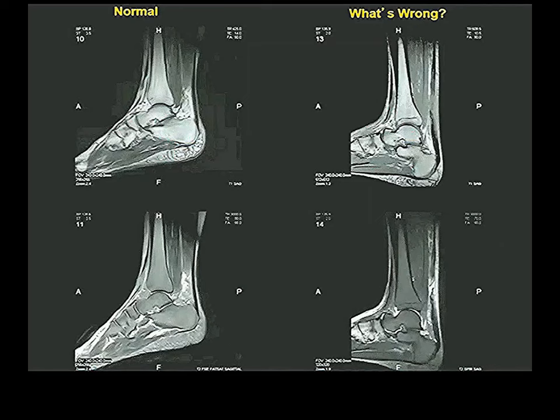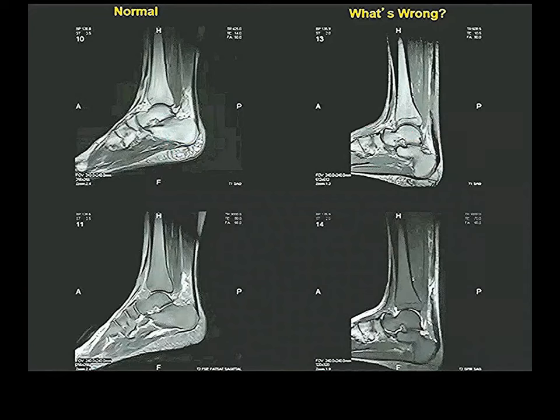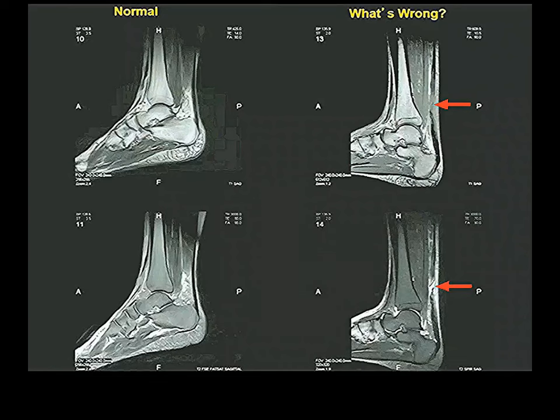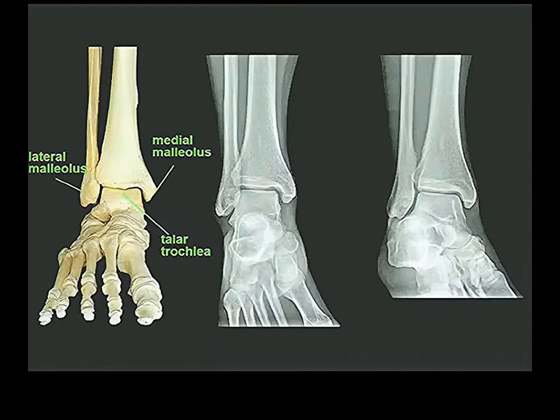On a sagittal MRI of a normal person: tibia, calcaneus, talus visible. Anybody see anything wrong? — Achilles tendon tear. Complete rupture — right there. You see it much better in T2 than in T1. This is a complete tear of the Achilles tendon.